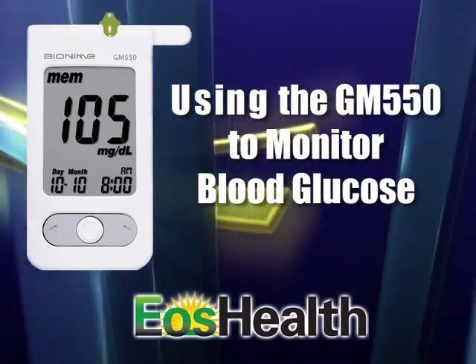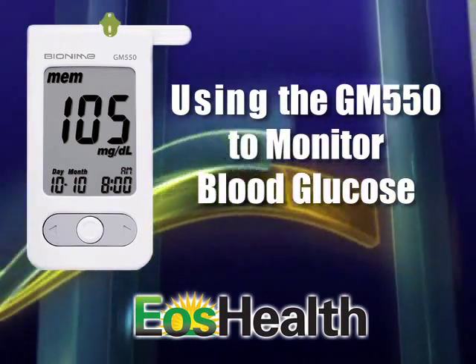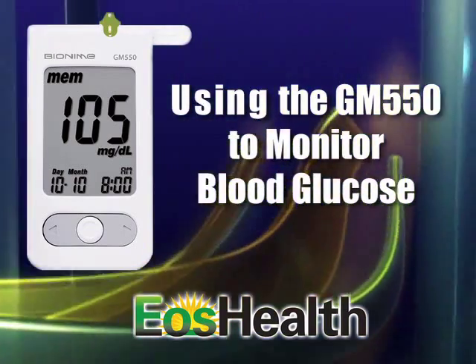In this part of the video, we'll go over the steps for monitoring your blood glucose using the GM-550.